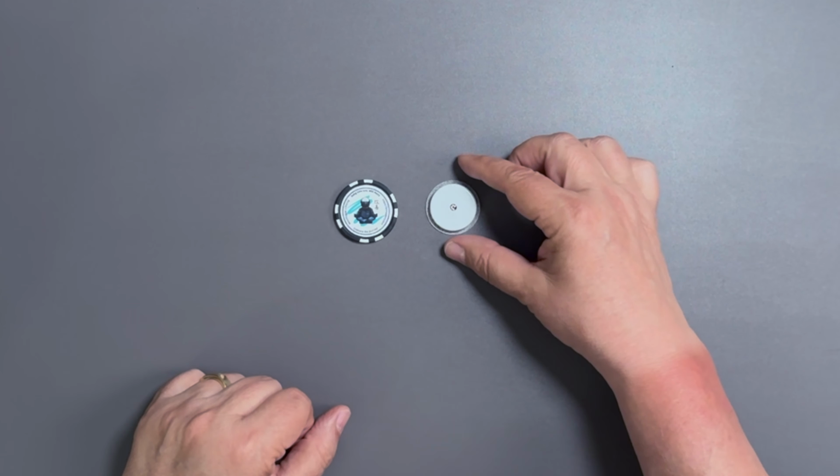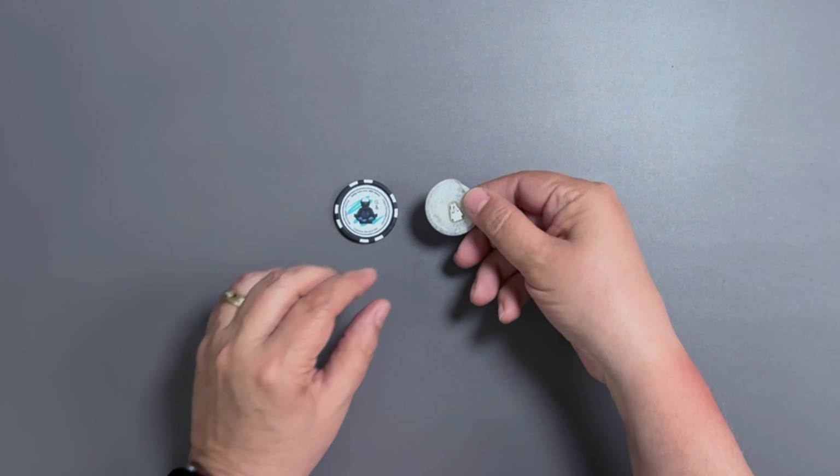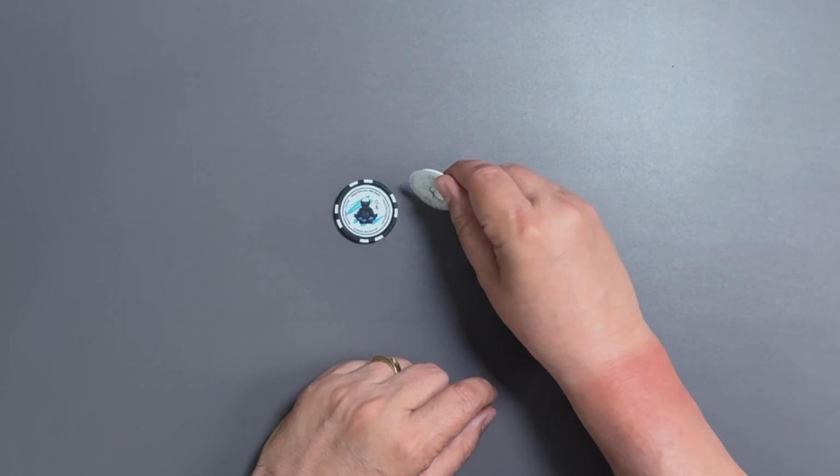Now, a couple of years ago, I decided that I'd had enough of that, and I switched to wearing a continuous glucose monitor, or CGM. And it's been a total game changer for me. If you're not familiar with CGMs, it's a small device that you attach to your body that inserts a very small, fine filament underneath your skin. I use the FreeStyle Libre 2. This that I'm showing here on the screen is one I just took off about an hour ago because it reached the end of its 14-day life expectancy and expired.